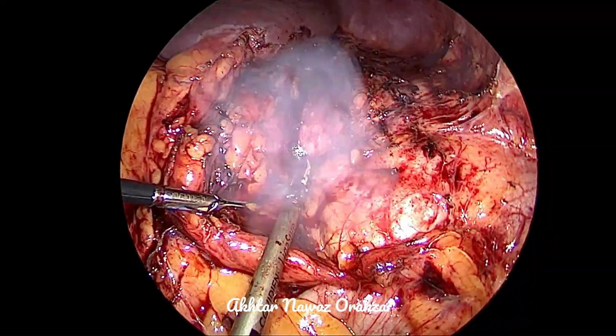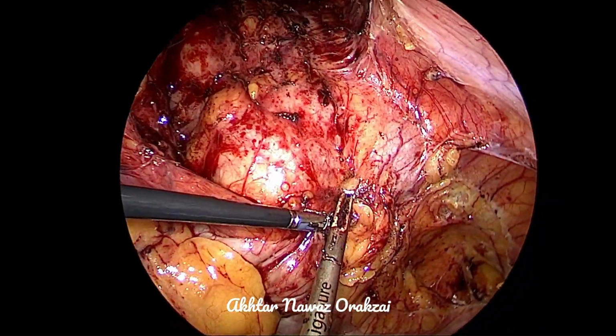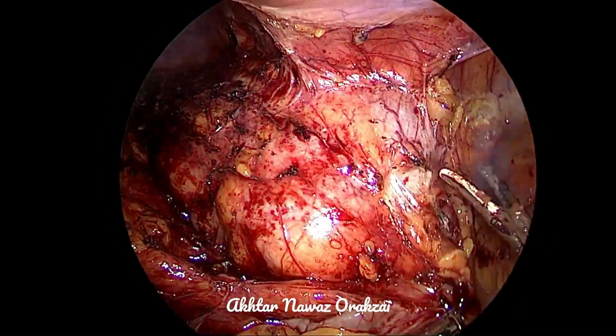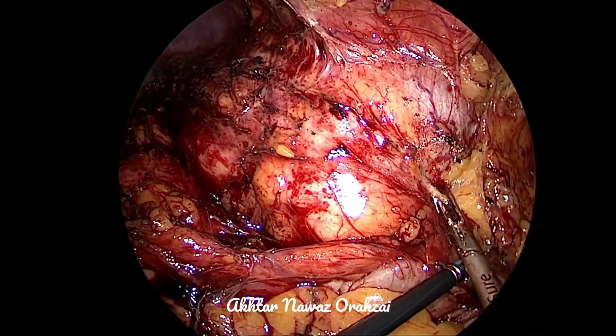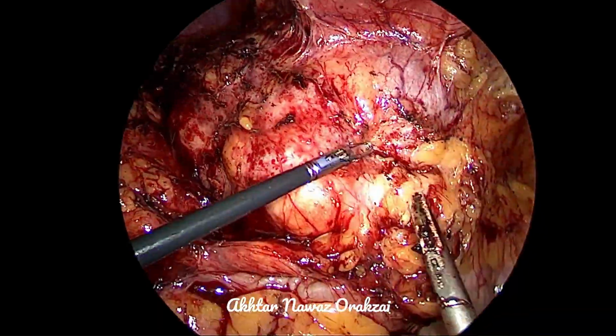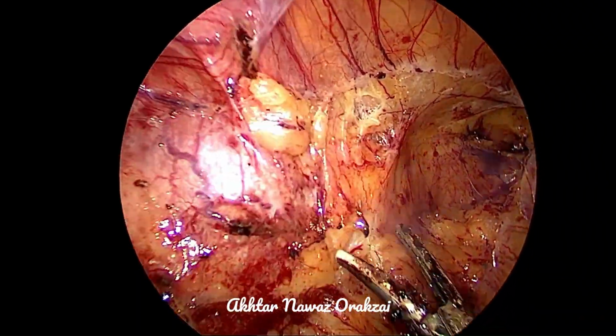However, splenic vascular injuries can lead to a loss of spleen, and that too, splenectomy will not be that easy. So care must be taken, and dissection must be performed bit by bit.